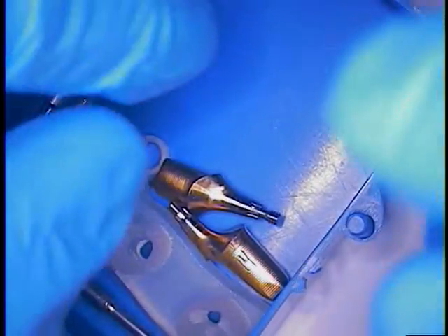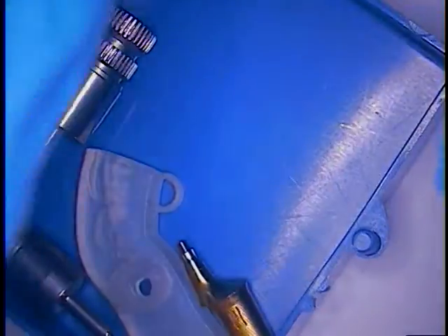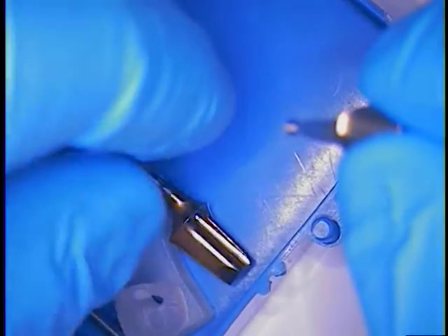I'm going to go ahead and show you the parts to this case. This is an implant-supported bridge and it will be screw retained. These are the components that I ordered from Dent Supply.